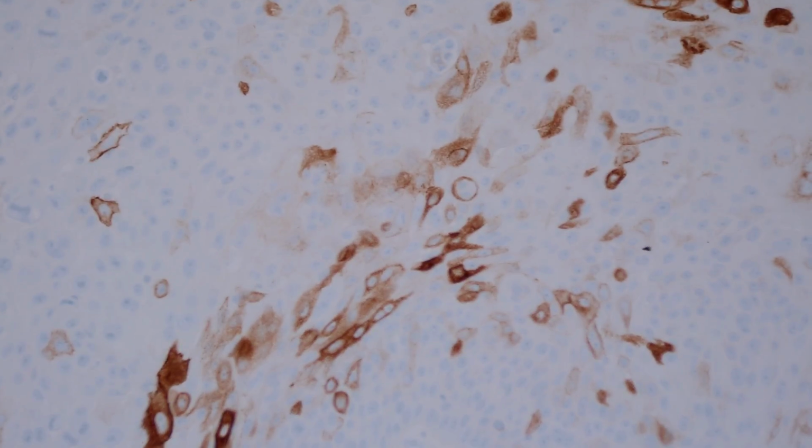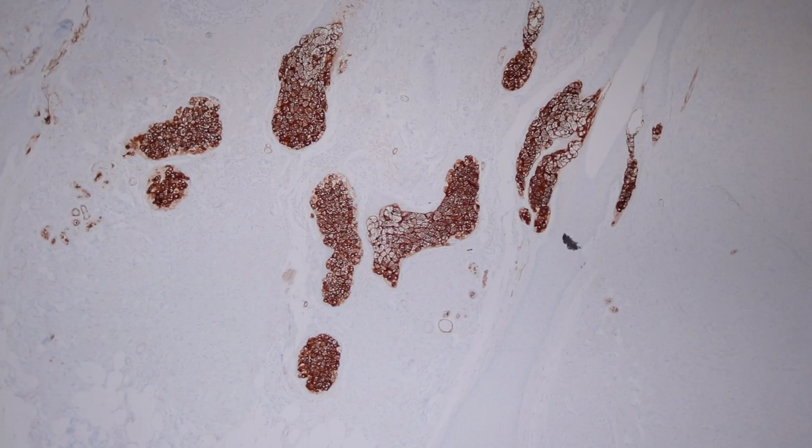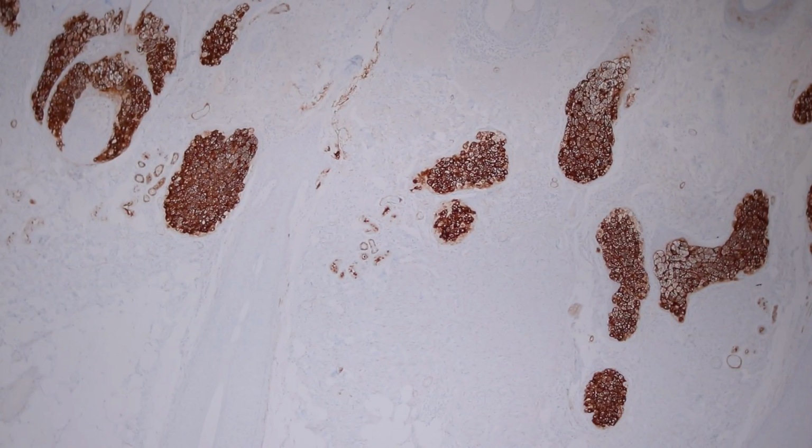They all have their weaknesses. But when you're looking in a sebaceous carcinoma, what you want to see are those actual bubbles that are highlighted by EMA, like I showed you in the normal sebaceous gland. And here, this is just cytoplasmic staining, so this by itself doesn't mean something is sebaceous. All right, so squames can have EMA expression sometimes. So here, that's the beautiful sebaceous glands. It's hard to look away from them, they're so pretty.